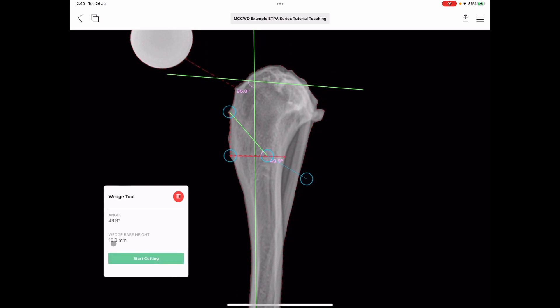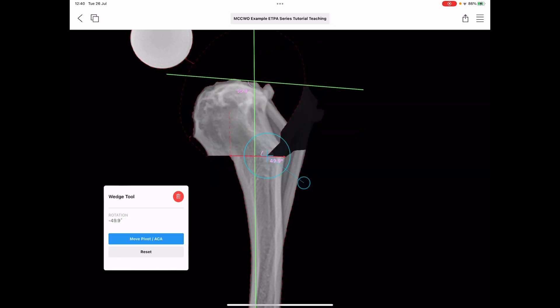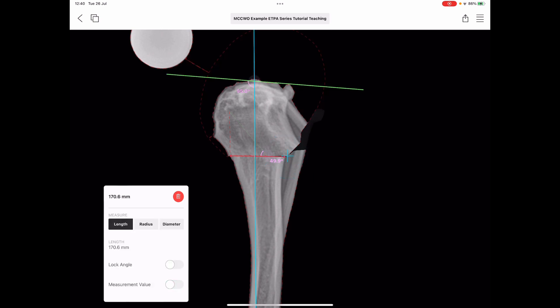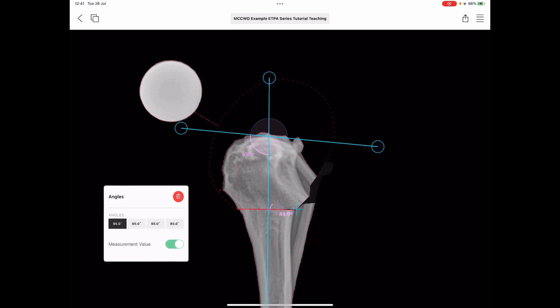Zooming in for accuracy, we've got a wedge of approximately 50 degrees. Now we reset the repositioned fragment — put that back to normal — and we have our wedge that we can then reposition. The hypotenuse of this wedge is going to be equal to the transverse osteotomy component. We place it on our baseline where we need it. The wedge base height for this position is 18.3mm, the wedge angle is 49 degrees, and we start cutting.